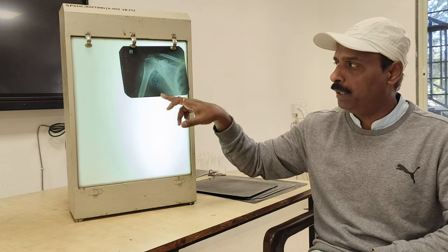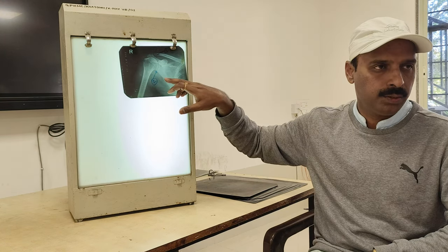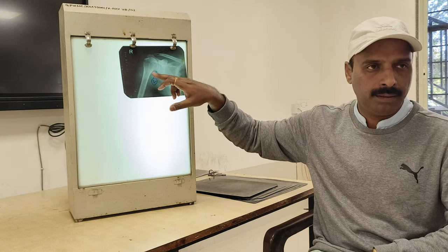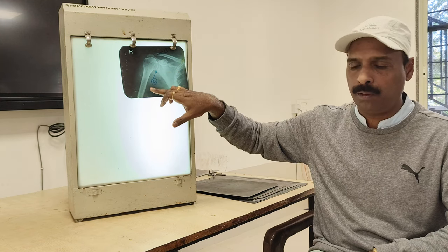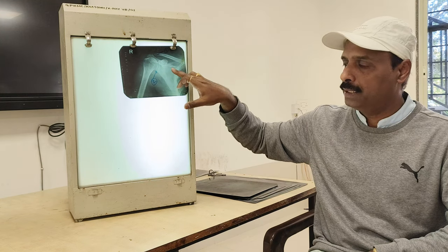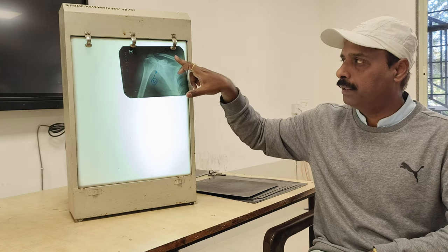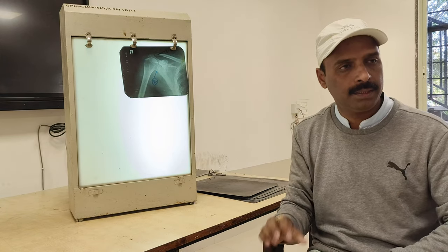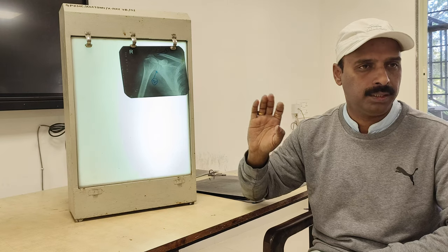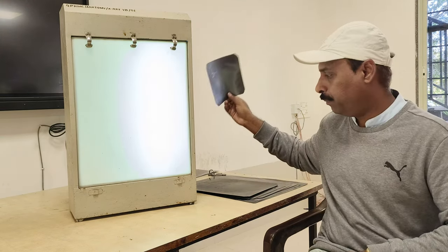So you have to mention first that this is a right shoulder joint, showing the different bony parts: the head of the humerus and shaft of the humerus, the glenoid cavity of the scapula, the lateral border and medial border of the scapula, and we have the clavicle. So this is very important to identify the plain X-ray of the right shoulder joint. This is what you have to remember.